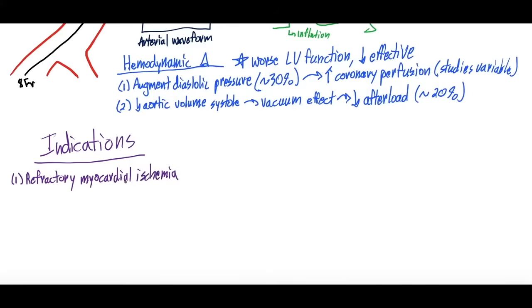These are patients waiting for definitive therapy who have complex coronary disease that needs more advanced therapy that might not be able to be given at that moment, so you can put in an intra-aortic balloon pump. Why? Because as we talked about, it increases coronary perfusion pressure to try to optimize myocardial blood flow and decrease the ischemic burden.